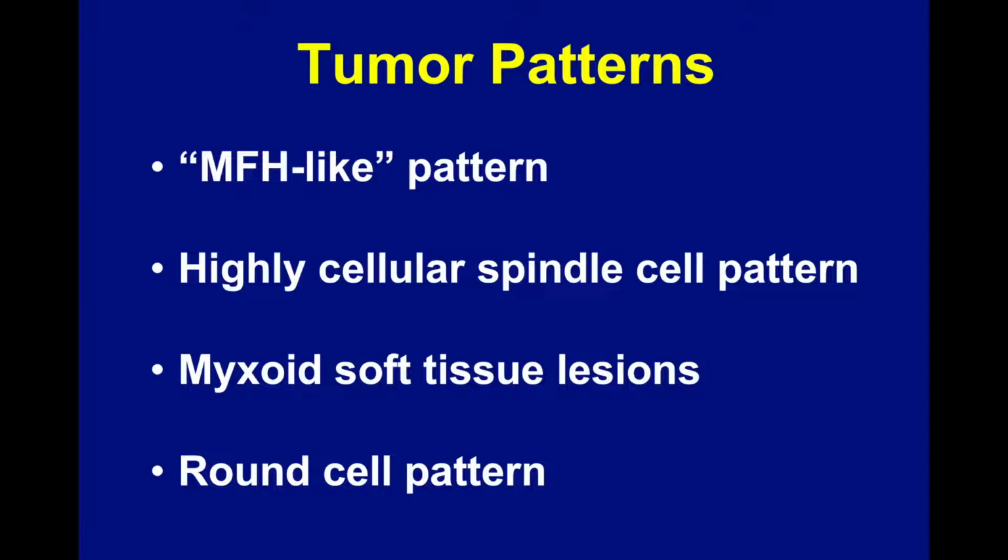Surgical pathologists encounter soft tissue lesions with myxoid stroma not infrequently, and unless you deal with soft tissue with some regularity, there's a tendency for the practicing pathologist to get a little bit antsy when one sees a myxoid soft tissue lesion. What I hope to do is not to give you a summary of every single myxoid soft tissue lesion, but basically an approach to a soft tissue lesion which has extensive myxoid stroma.